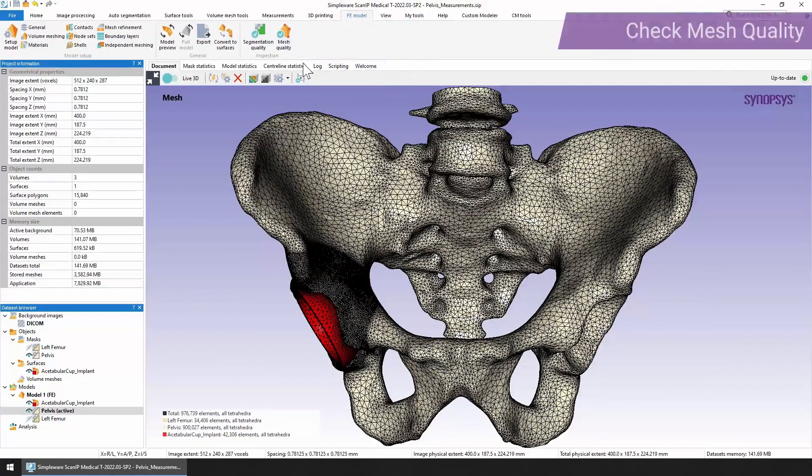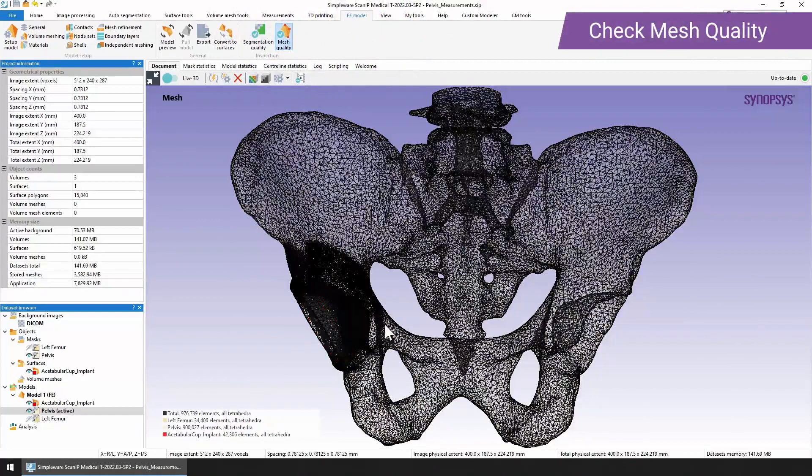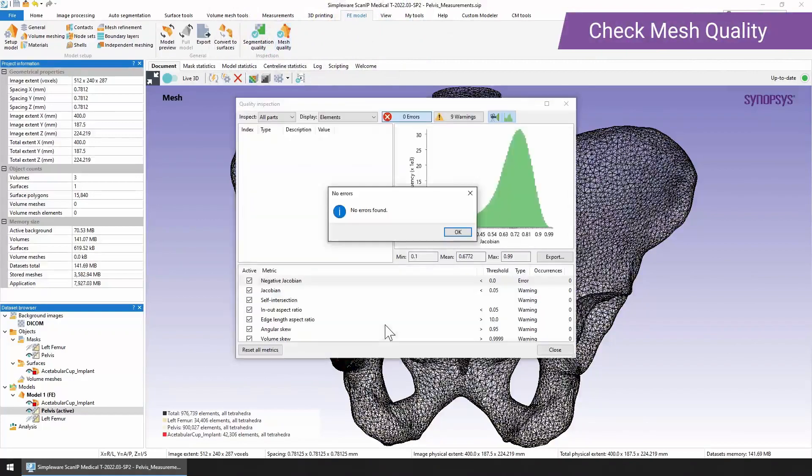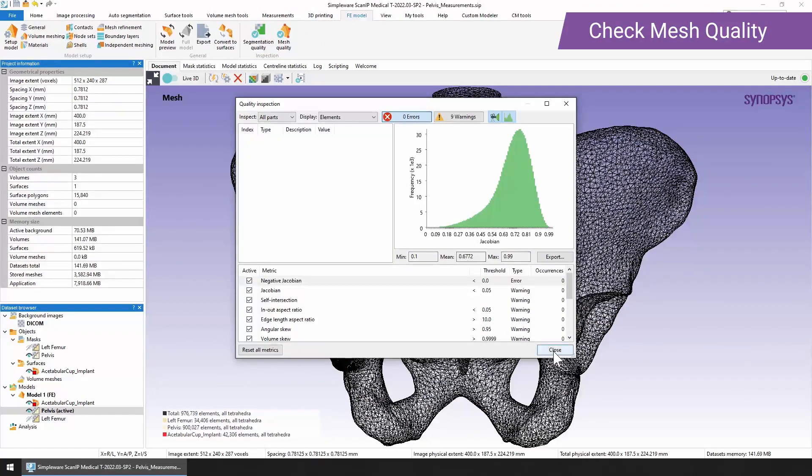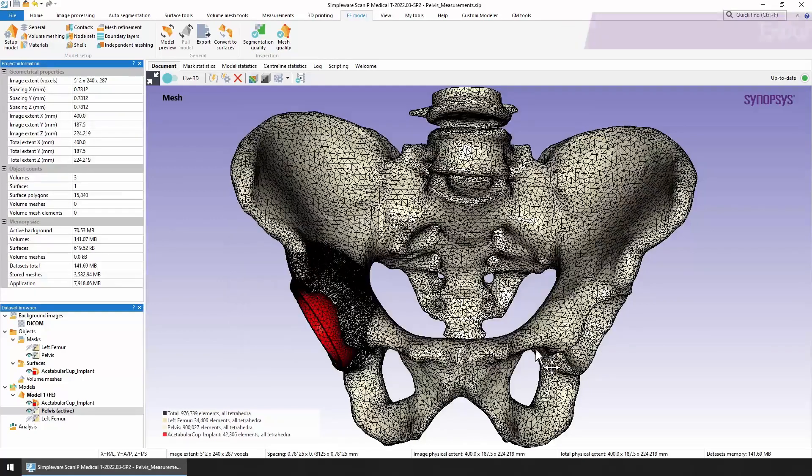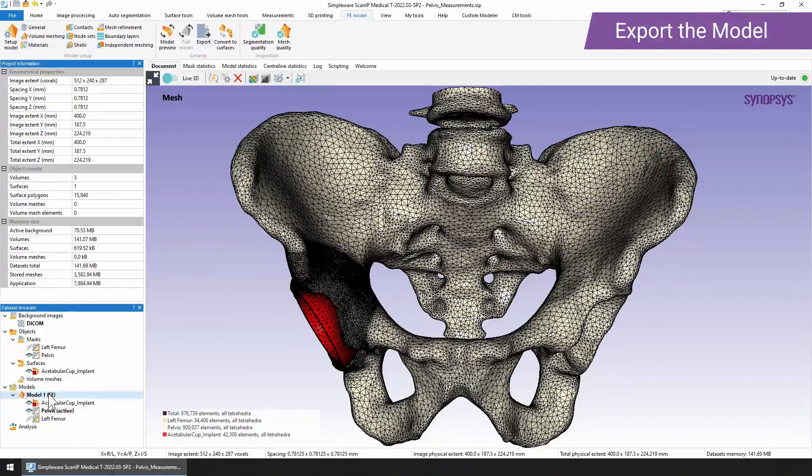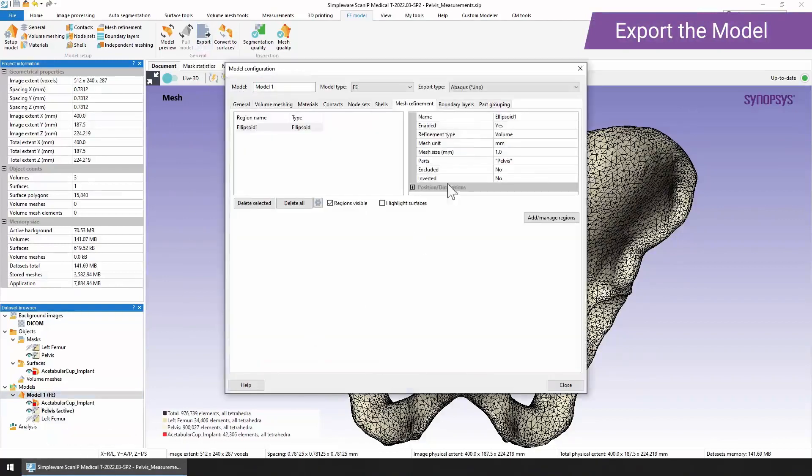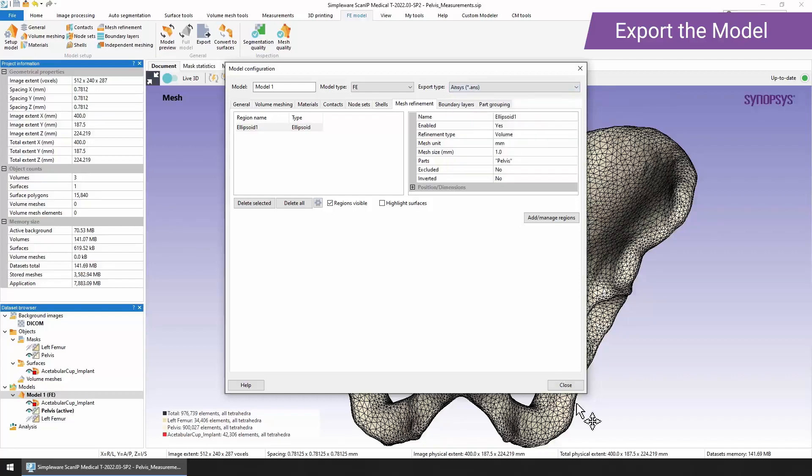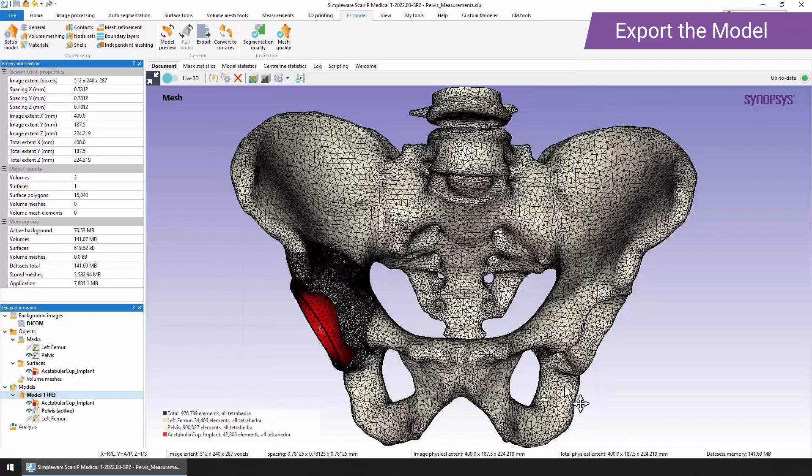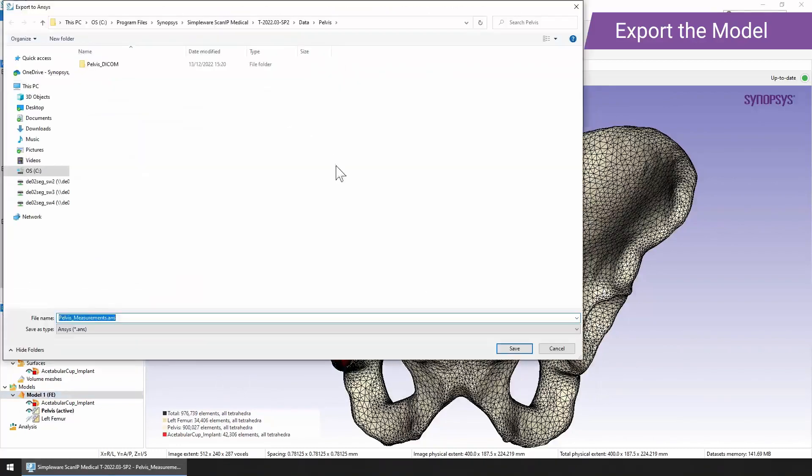From here, if we go back to the FE model, we can check the mesh quality. We can see that no errors have been found and just a few warnings here, and get some details about how you would inspect your mesh using our helping tutorial files. So at this point, you can just now select export in the format that you've chosen. If you did need to change format, you can go back into the model configuration. And in a lot of cases, you don't actually have to remesh. You can just export straight away.